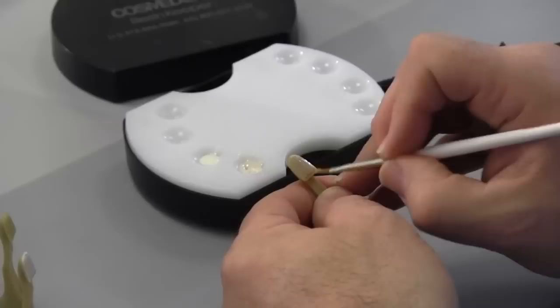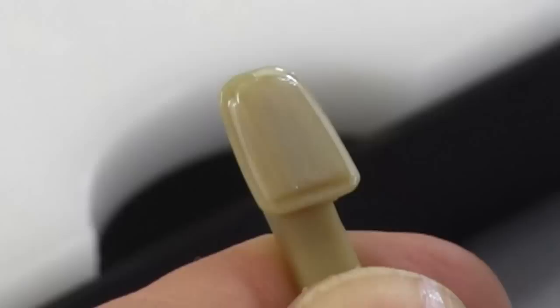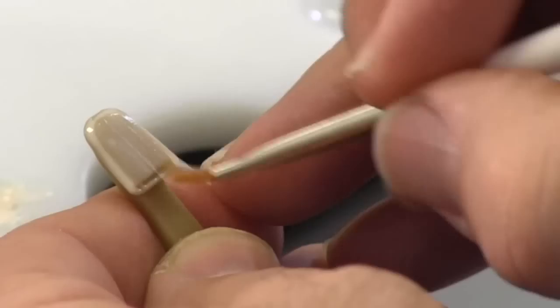The thinner the better to start. You can see this thin coat just lightly starts to change the color of that tooth without bringing the value up too much — it keeps it warm. Then we go ahead and polymerize this for 10 seconds, and then add another coat to that surface just to try and neutralize that color.